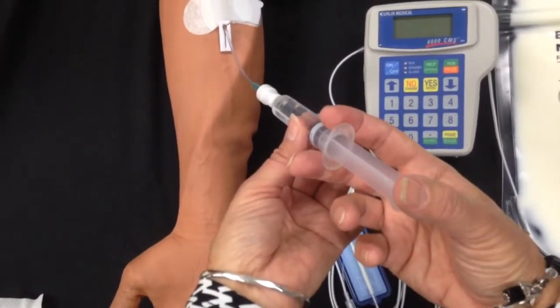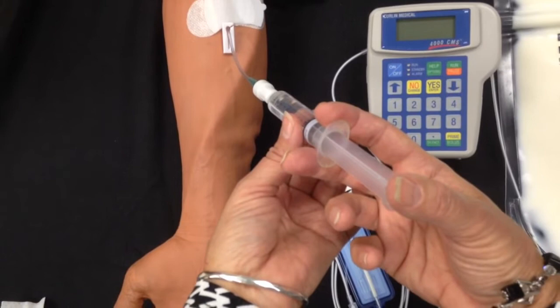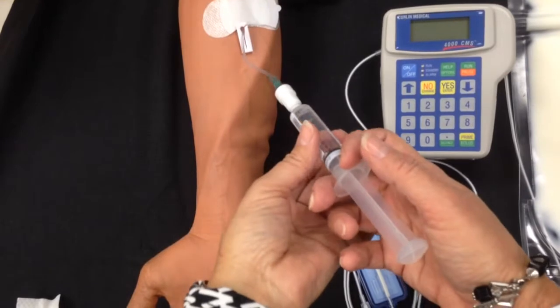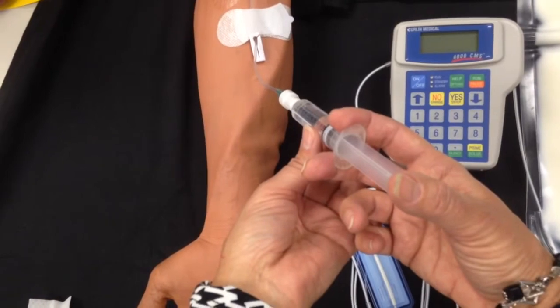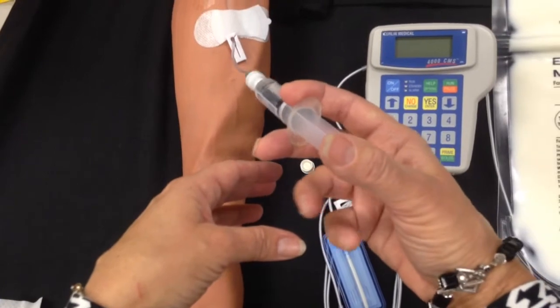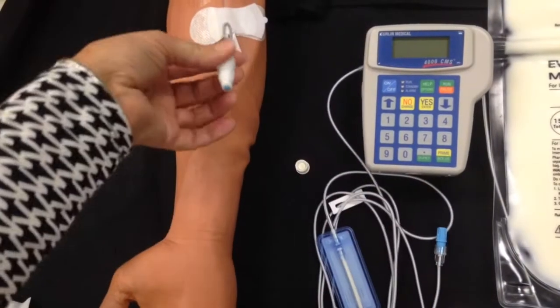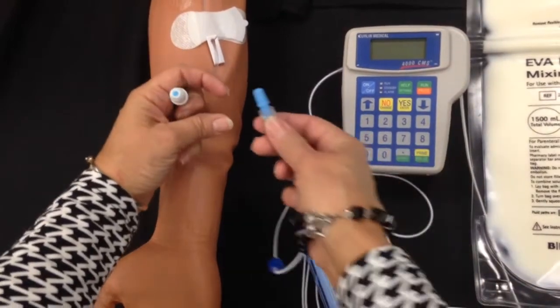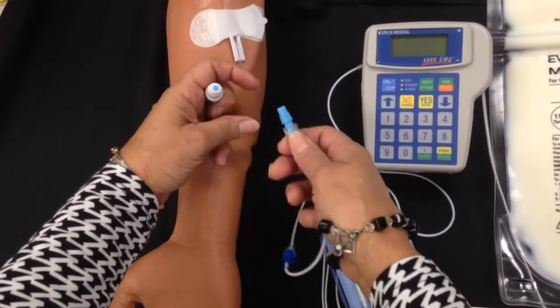So we're going to apply gentle pressure, and if there's no pressure, we can infuse. If there is pressure, you need to call the home health agency for further instructions. So with no resistance, we're going to apply some of that, and once we know that it's going in easily, then we're going to pulse in the rest of it. Okay. If you at any time lay this down on the patient or on a surface, you need to re-alcohol wipe.